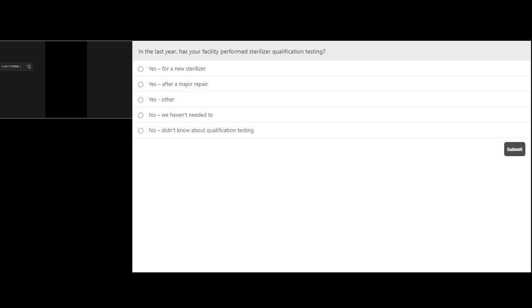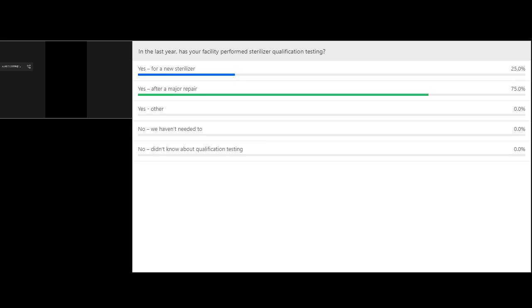Okay, let's see what the poll said. Ooh, well, hey, this is great, really great. 25% of you were lucky enough to get a brand new sterilizer and knew that you needed to qualify it before you put it into service. 75% of you had a major repair and knew that you needed to qualify your sterilizer after that.